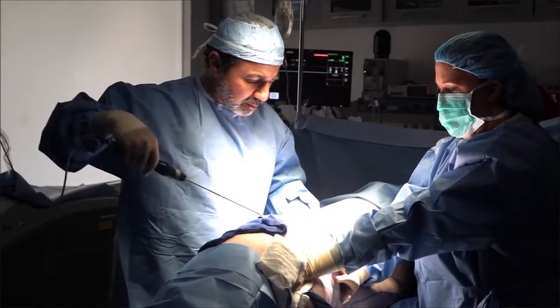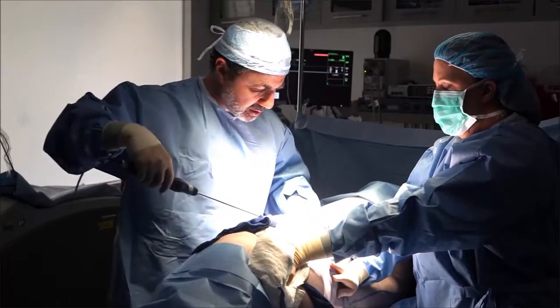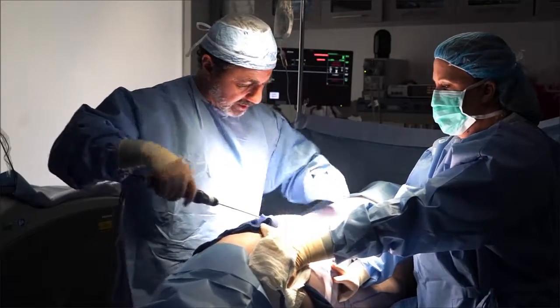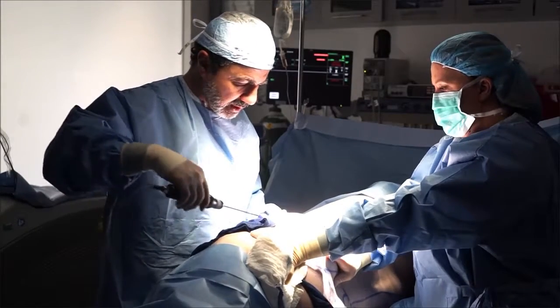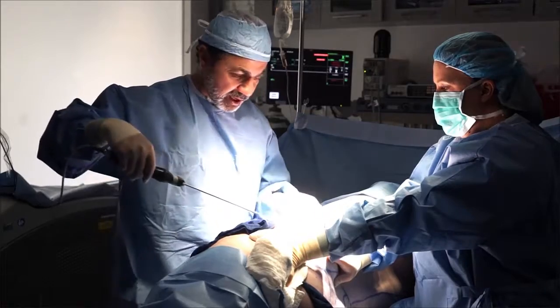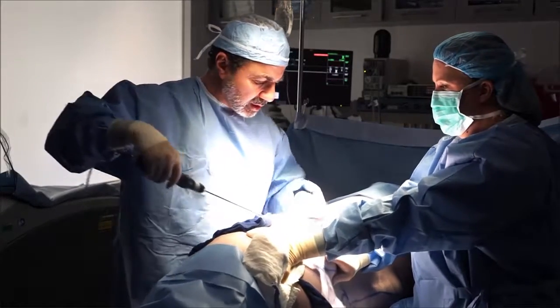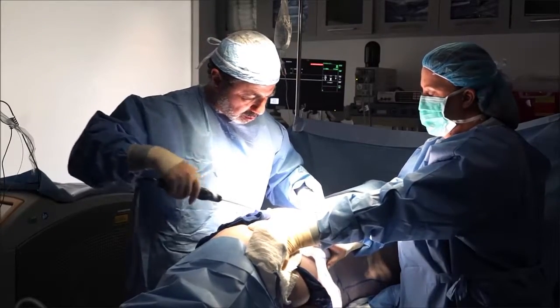So we're a little more than an hour into this procedure, and I have spent the first hour almost putting in the tumescent fluid using the wall. It not only numbs the tissue, but it helps to prepare it and hydrodissect it and loosen everything up and create a cleaner, more bloodless feel.